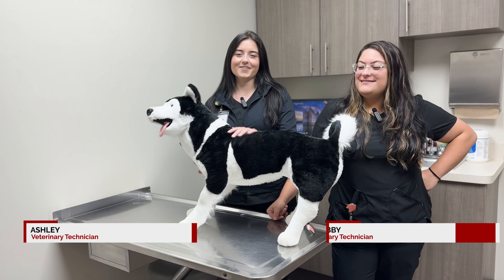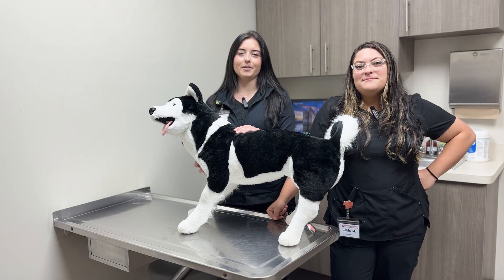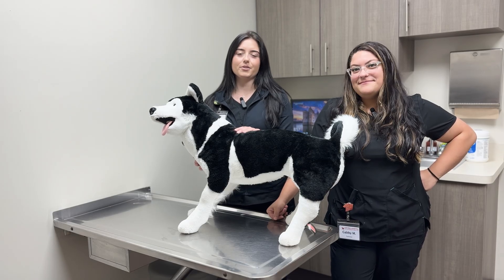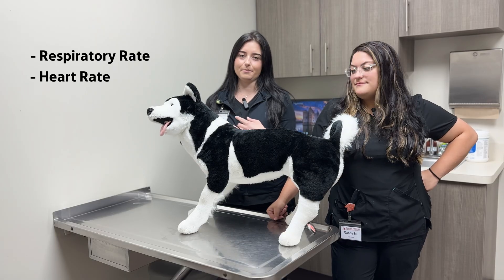Hi, I'm Ashley and I'm Gabby, and this is our demonstration dog Biscuit. Today we're going to be showing you how to check your pet's vitals from the comfort of your own home. We'll be showing you how to check the respiratory rate, heart rate, and temperature.